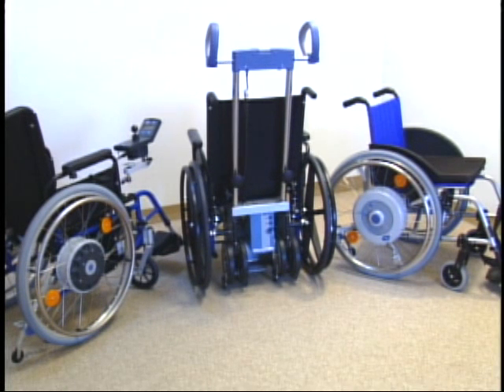Frank Mobility Systems is proud to offer the following innovative products manufactured by Alber in Germany. Each product is unique and provides the user with state-of-the-art technology for unrestricted mobility.